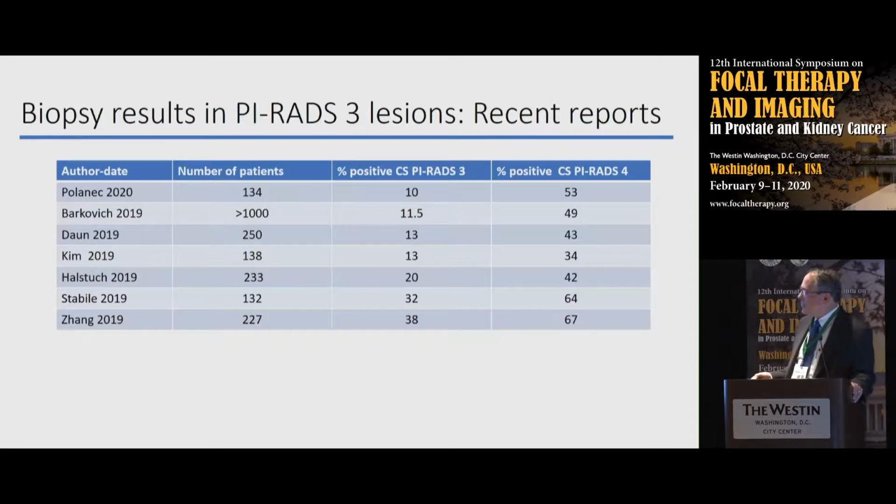And so I was thinking, well, maybe this will be reflected in these same studies: if you're going to be sort of hard about what's a 3, then that should be reflected perhaps in a higher 4 positivity rate. But there doesn't seem to be any relationship between them; there's a vague relationship between what you do at 3 and what you do at 4. So it's a little bit of a confusion. But there will be no definitive answer to my talk.